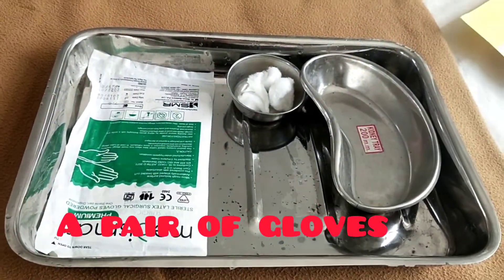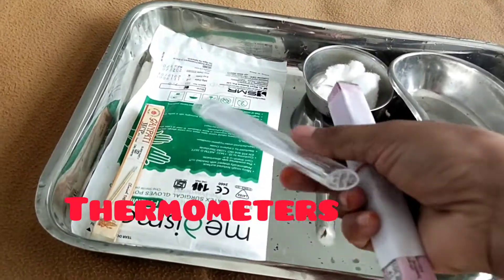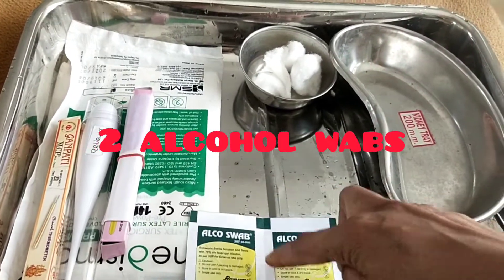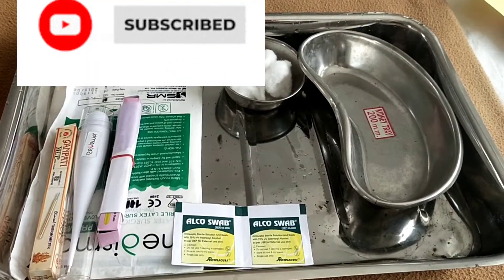Next, I take a pair of gloves. Here I am taking three thermometers: a rectal glass thermometer, one digital thermometer, and an oral glass thermometer. Next, I take two alcohol swabs to clean the thermometer.